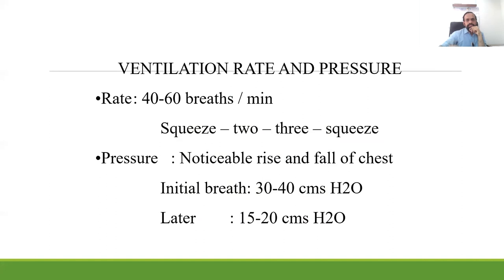So how will you give positive pressure ventilation? At a rate of 40 to 60 breaths per minute. So you can say like bag 1, 2 or bag 2, 3 like that. Then it will deliver around 40 to 60 breaths per minute. And it should give a good seal so that there is a chest rise. And it is similar to the EC technique. Newborns also will do the same thing.